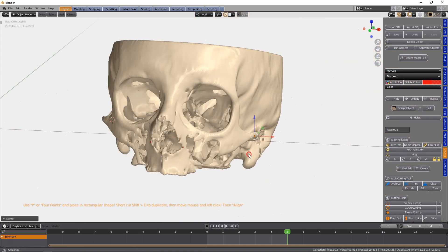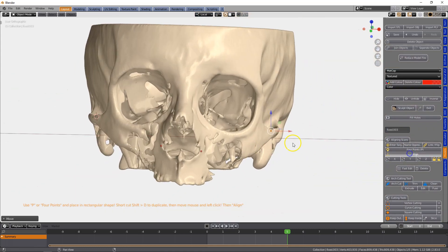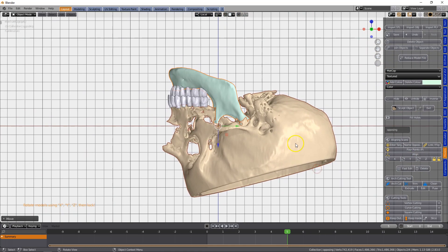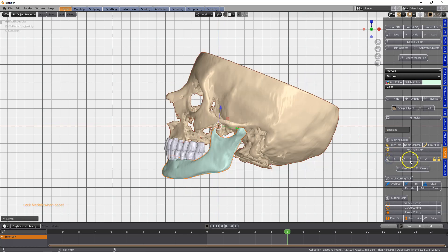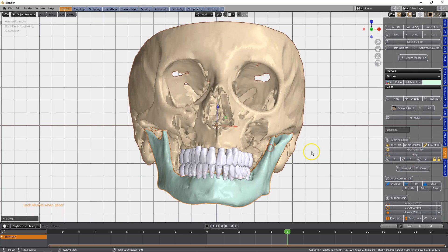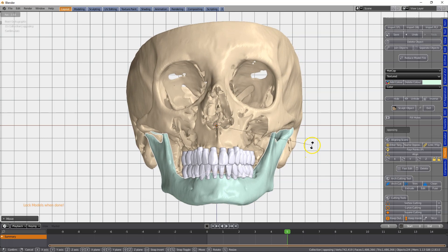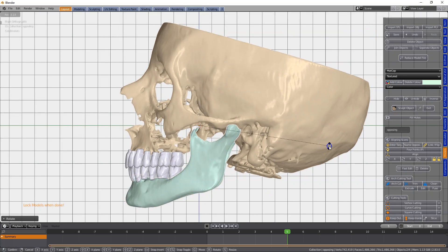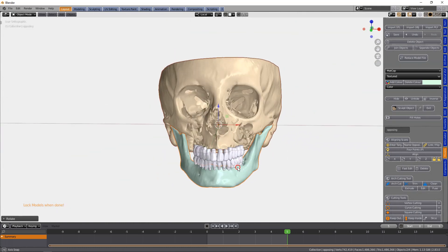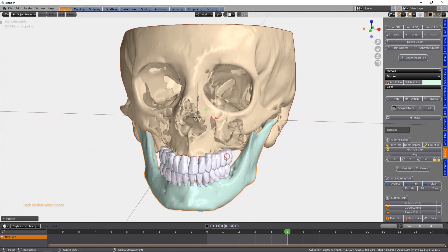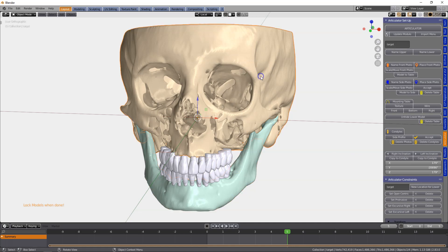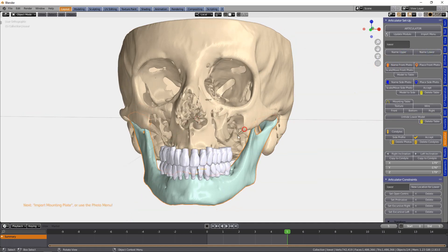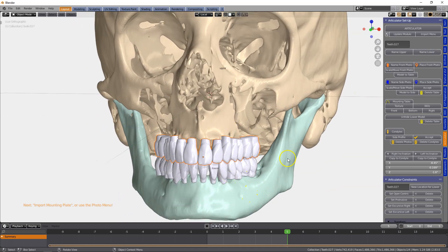Following that, we're going to click on align and then flip it over on the X-axis twice and once on the Z-axis, then rotate and fine-tune it a little bit. Now that it's in the center of the workspace, we go to the articulator and name the top upper and the mandible lower.